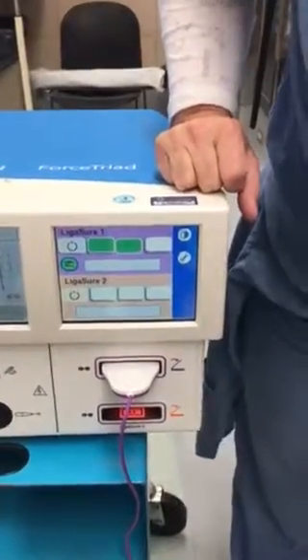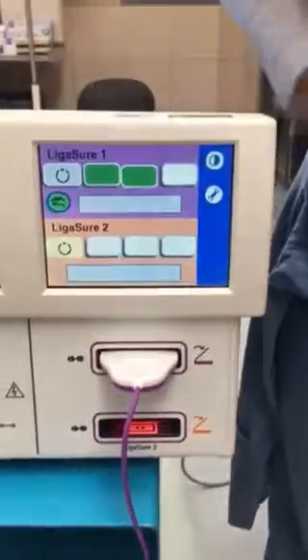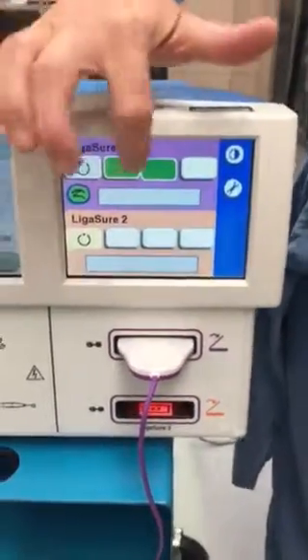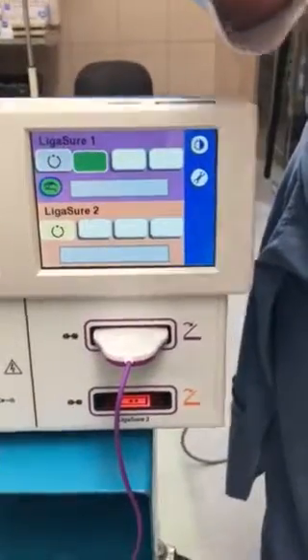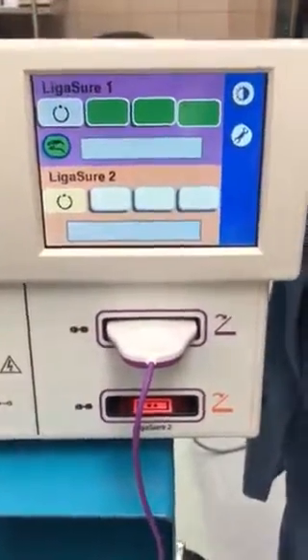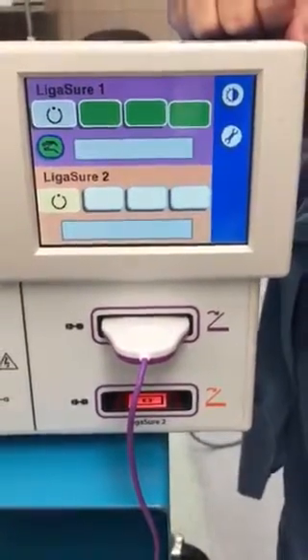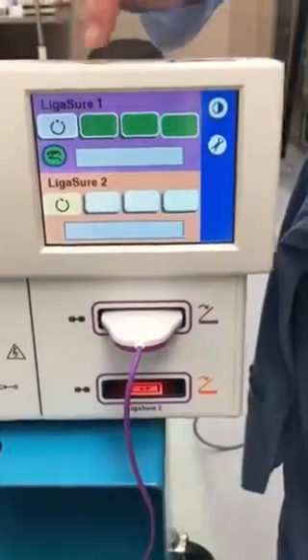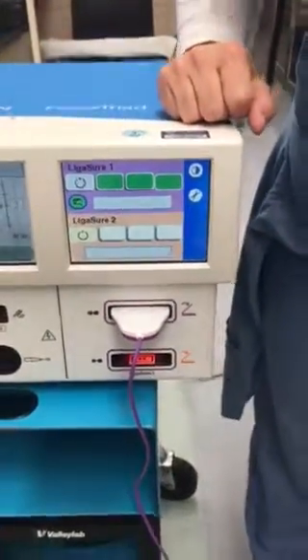Typically, our physicians are going to want it on full strength. These green bars here, those are our strength. So if I press just the single bar, that's strength number 1. That's the least amount. 2 is middle, and 3. That is how you would raise it all the way to the 3rd bar, and that's how the physicians usually use this machine, by either bar 1, 2 bars, or 3 bars. And pretty much that is all you would have to do.